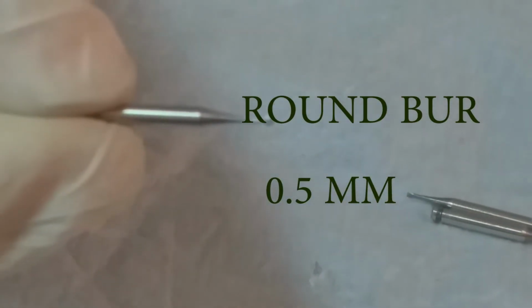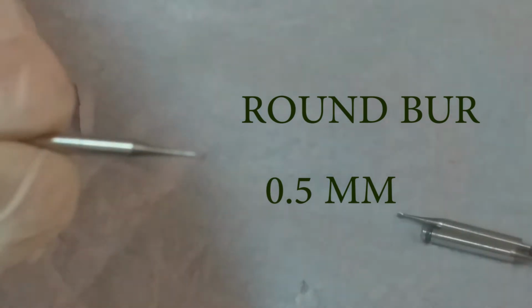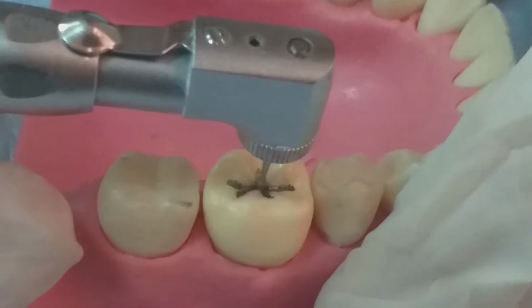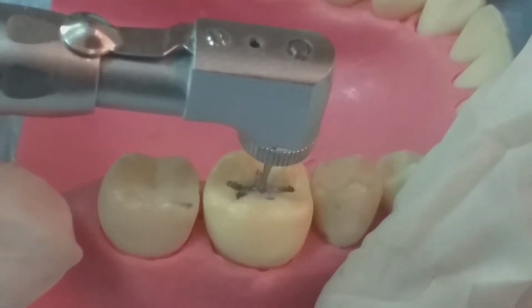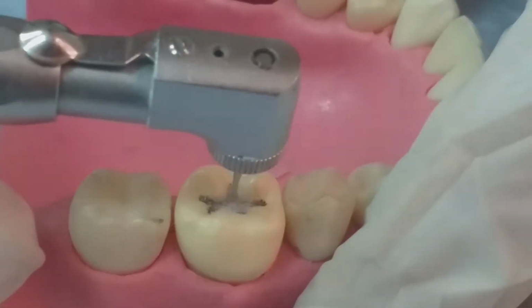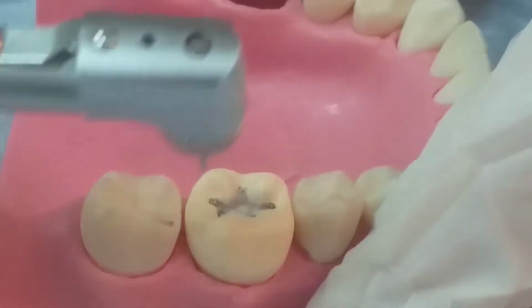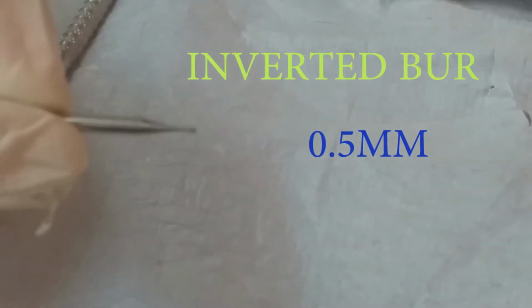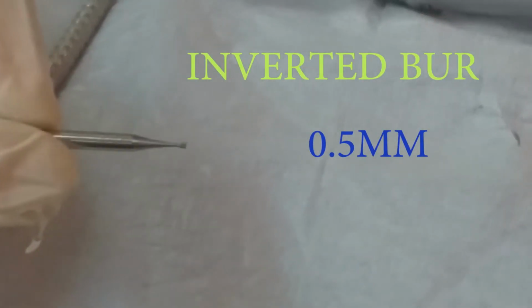This is our round bur. We choose small diameter 0.5 for gaining access in the central pit. Our purpose is to make a cavity with 1.5 millimeter depth. So first drill 1 millimeter, then complete it to 1.5 millimeter in preparation.